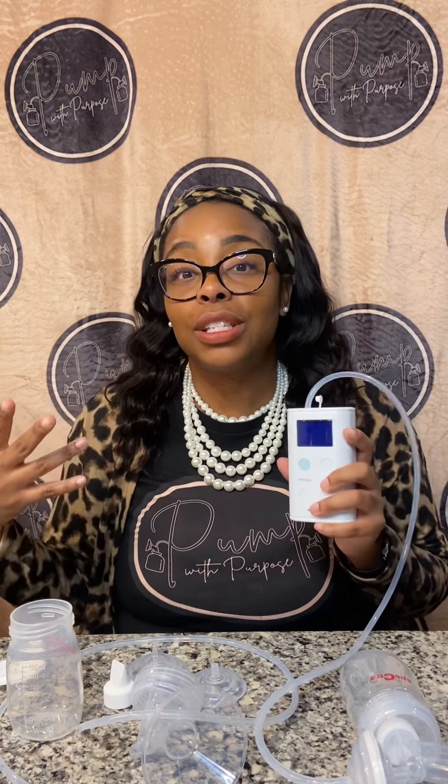I want to get my full disclaimers and disclosures out up front. I purchased this pump myself — I had some extra funds on my FSA card. I owned this pump before and I gave it away, but I kept getting so many questions, so I ordered it again. And then I remembered why I gave it away — but hold tight, because it's not what you think.